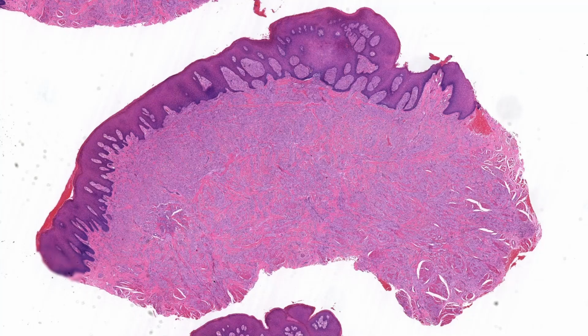Below the mucosa, there is not much non-lesional tissue to assess, since the tumor extends to both the peripheral and deep section edges. Because of this, we also cannot determine the size or depth of the lesion. The tumor itself appears to be composed of vague nests of eosinophilic to amphophilic cells. Between the nests are bands of bright eosinophilic material, possibly collagen.